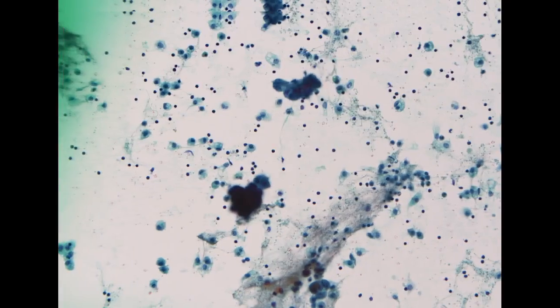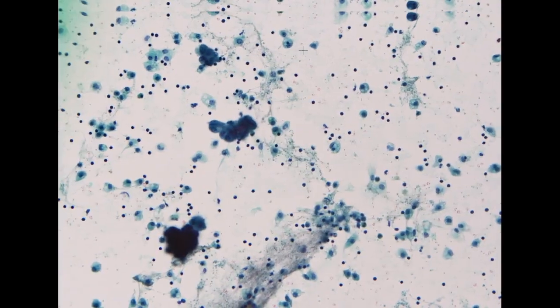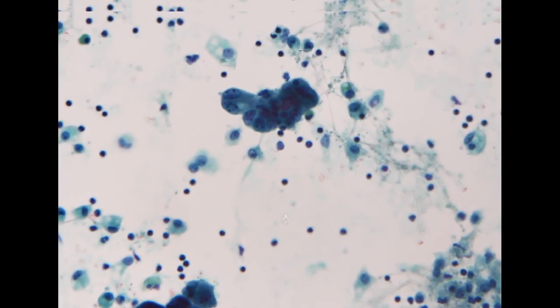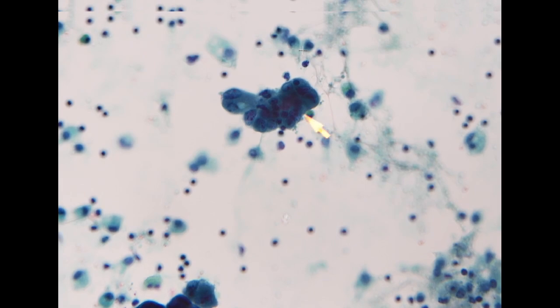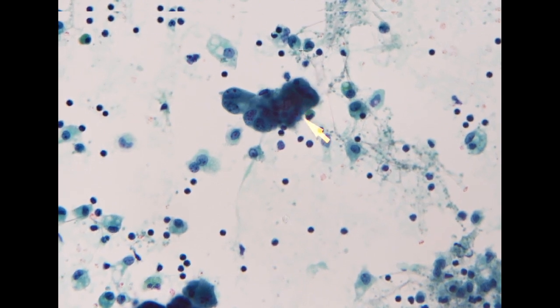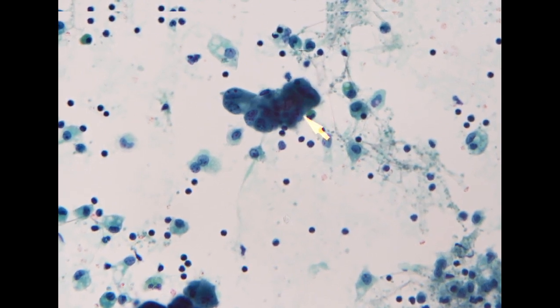So the history helps, but the bottom line is that we need to consider the cytomorphology. Again, these clusters also demonstrate atypical cells with a three-dimensional glandular feature, and this is not showing the morphology of a mesothelial cell. So this is considered also as positive.